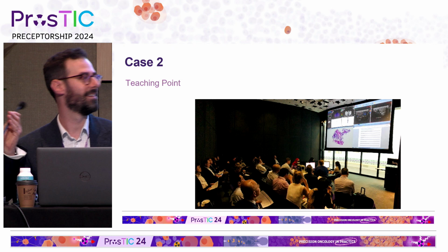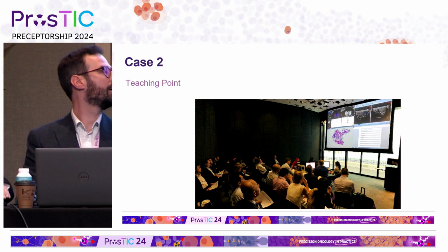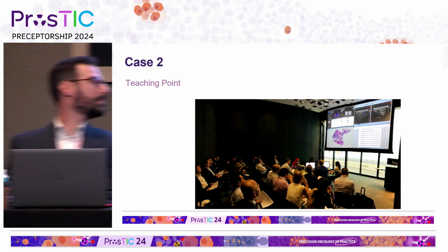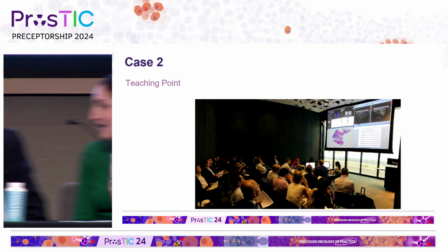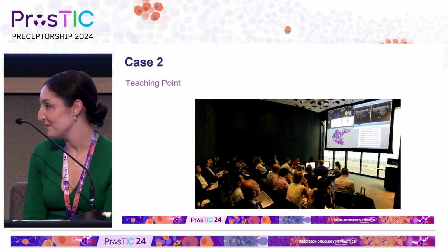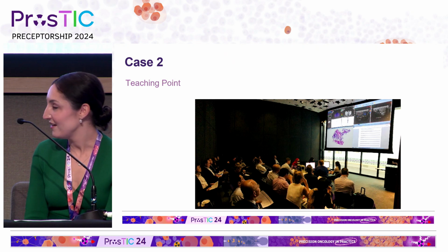I just wanted to add as well, I think from our point of view, biopsy is really important because we've had 2 cases recently, similar situation where there's been an isolated PSMA avid bone lesion, and on biopsy one of them ended up being a plasmacytoma and the patient was found to have myeloma. And the other one was very interesting.